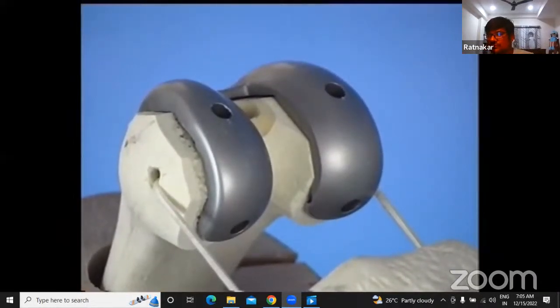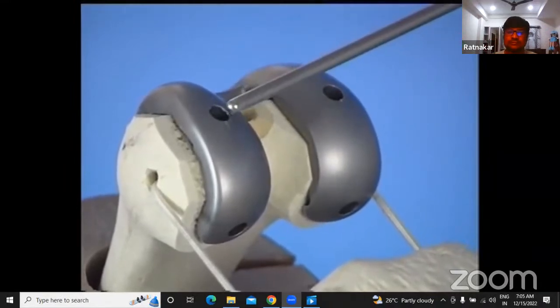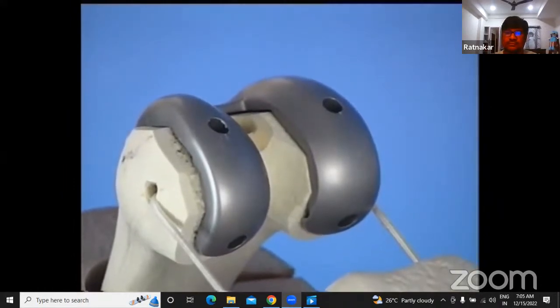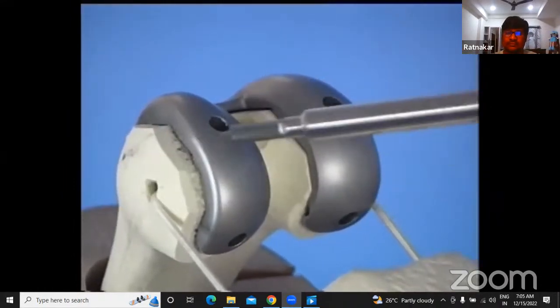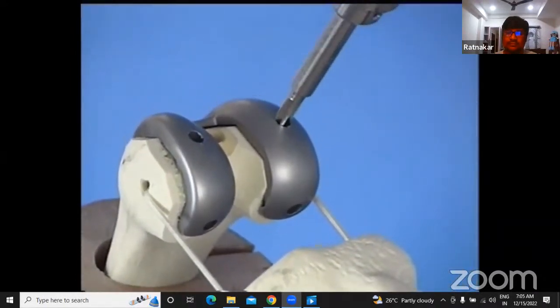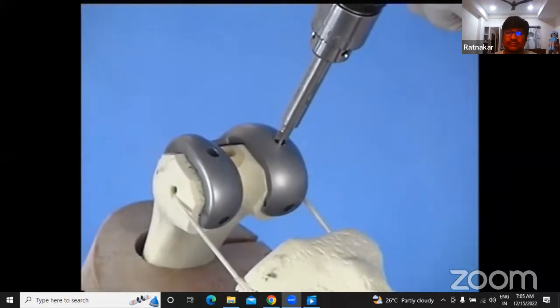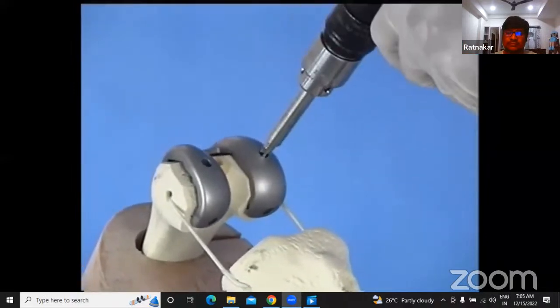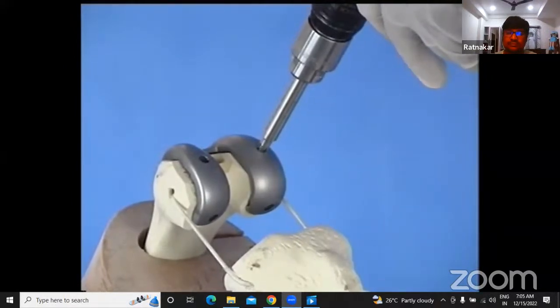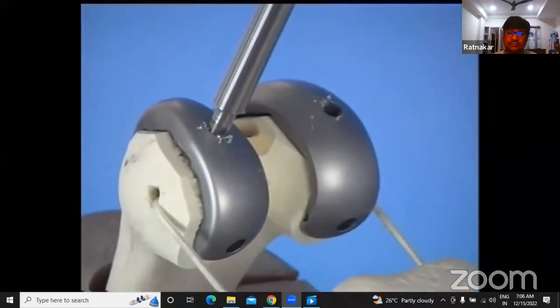Now once this femoral component is in place, you can see that there are lug holes here. These lug holes have to be drilled now, which will be anchoring the implant. That is the stop drill, and we are going to use this here. Another practical tip here is let this drill find its own way. You don't force it. If you force it, it might reposition the femoral component. So don't do that. Just let it go. That's it. And again, one on this side.